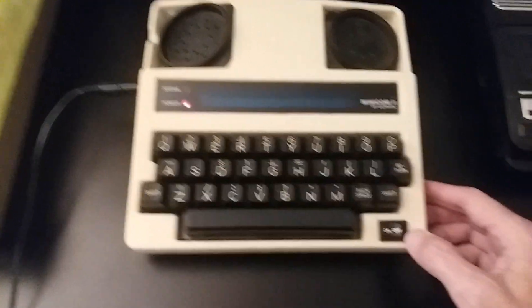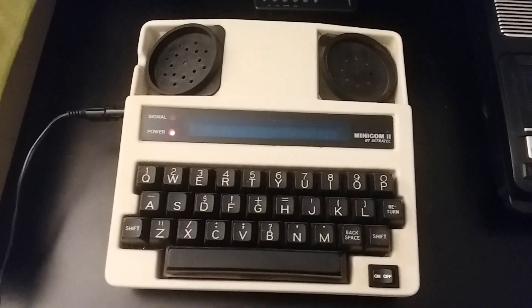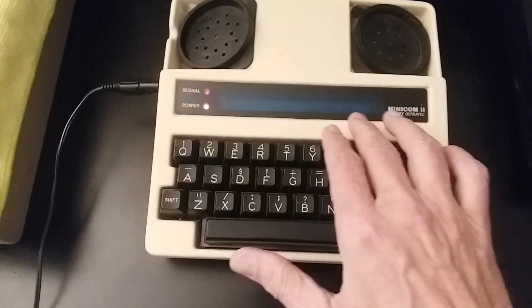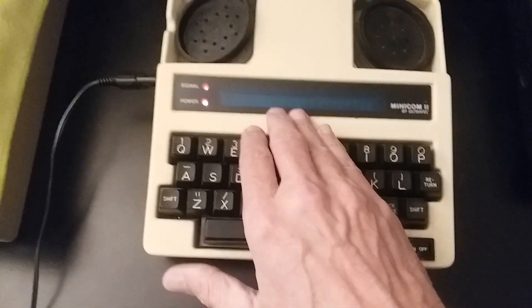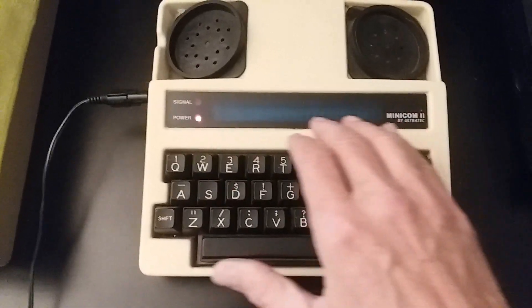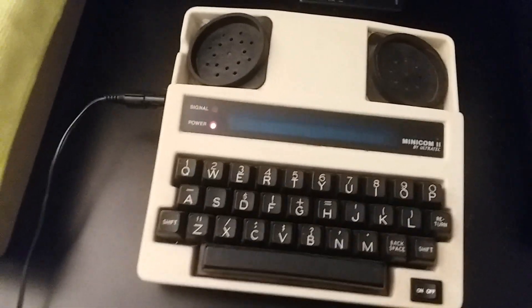Bad news is I purchased this off eBay and once again, due to the typical brutal handling of the United States Postal Service, it arrived damaged. Here on the LCD screen it will still decode and the text will come across, but there are two cells that are dead right in the center, so they don't show up as text and you have to kind of read broken text as it's coming through.